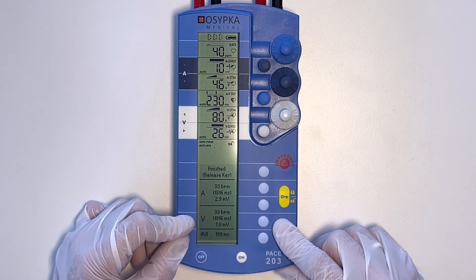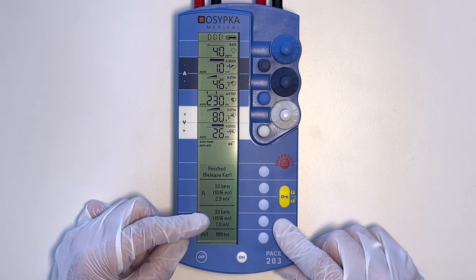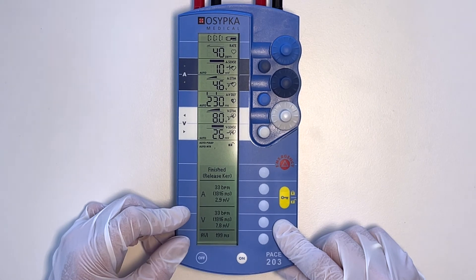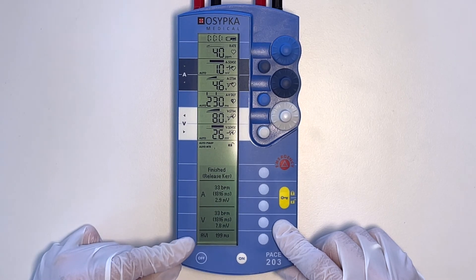The same is shown for the ventricle. 'V' stands for the ventricle — ventricular heart rate in brackets, the corresponding RR interval in milliseconds, and at the very bottom the R wave amplitude in millivolts; the value here is 7.8 millivolts. In the bottom section, the measured atrioventricular conduction time is displayed in milliseconds.